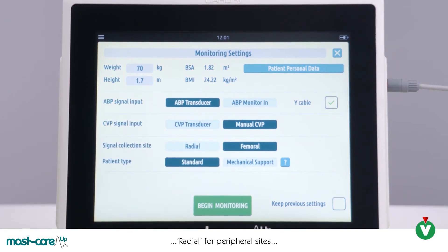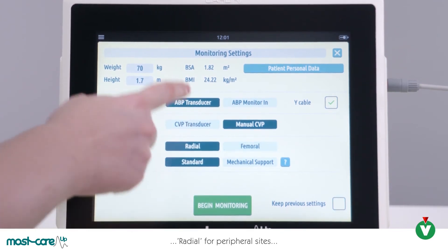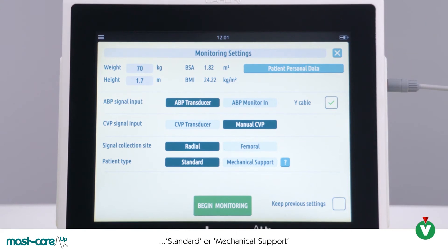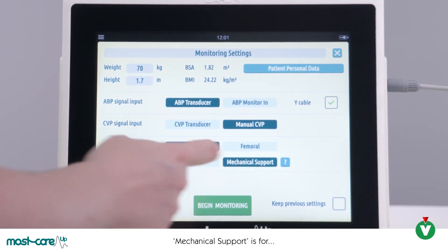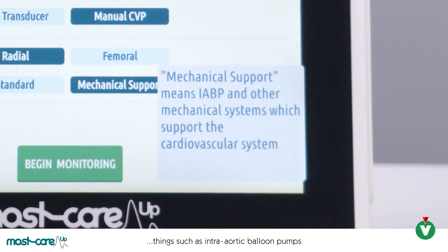On the signal collection site, for peripheral arterial catheter placement, select radial. Alternatively, select femoral. For patient type, the options are standard — which will be for the majority of patients, including those who need ventilatory support — or mechanical support, for patients who require cardiovascular support such as IABP.